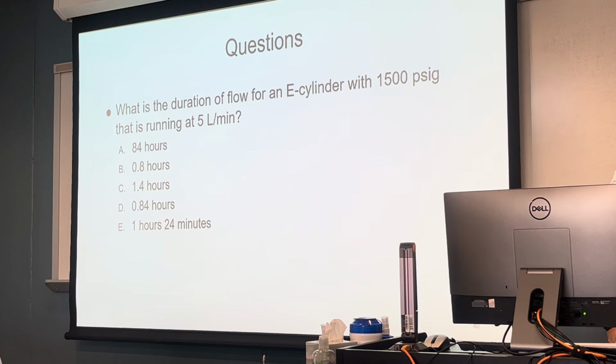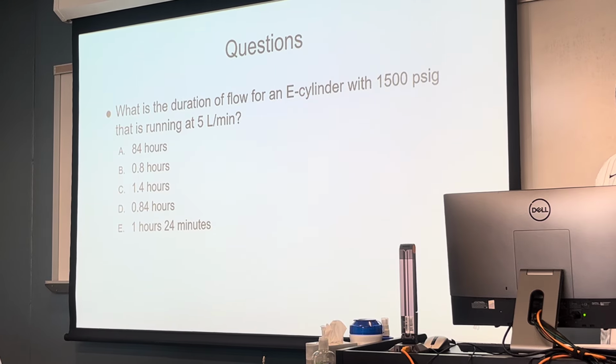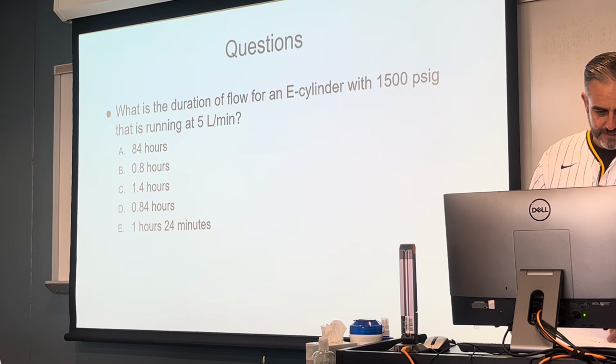All right, next question. What is the duration of flow for an E-cylinder with 1500 PSI that is running at 5 liters per minute? I know you're going to have to figure that out here, so go ahead and do that calculation. Tell me what your answer is.